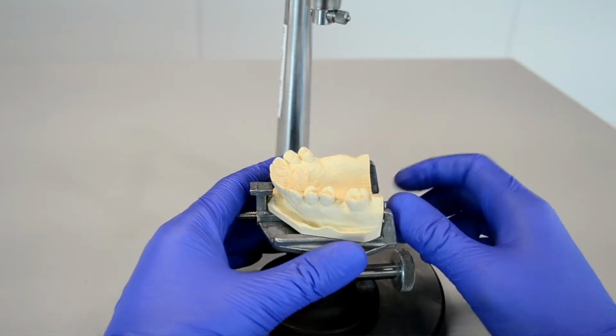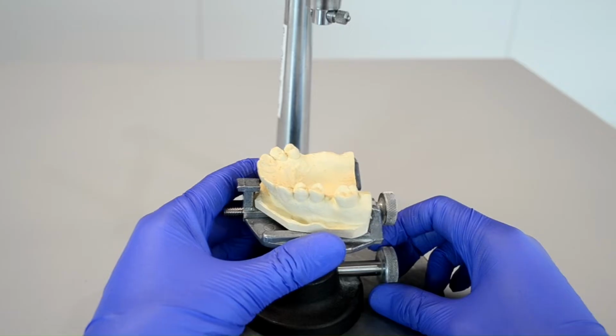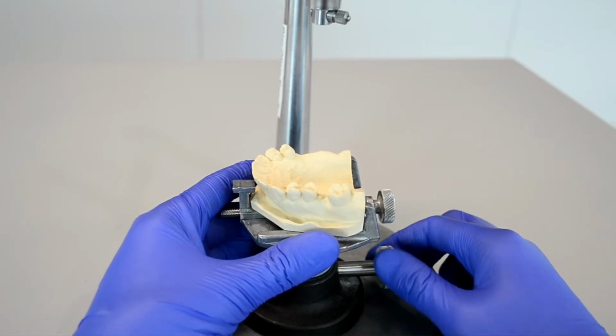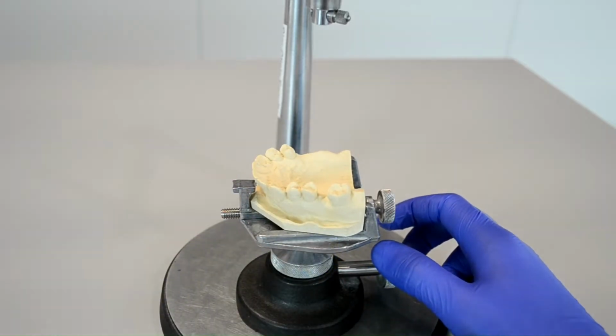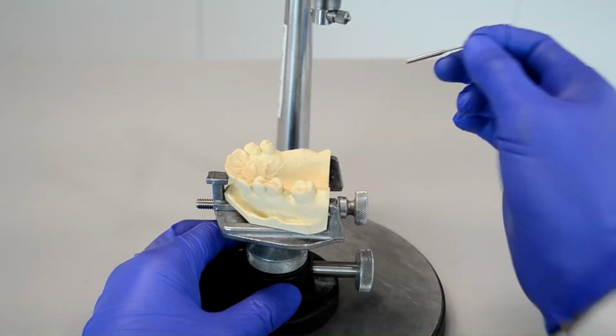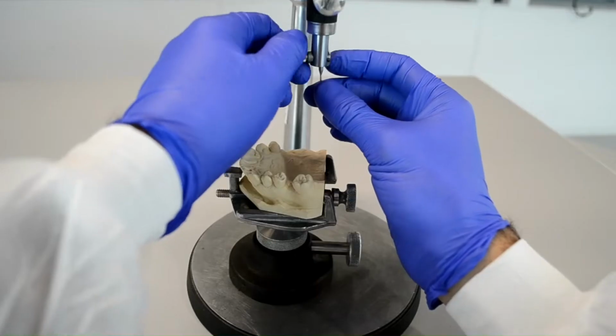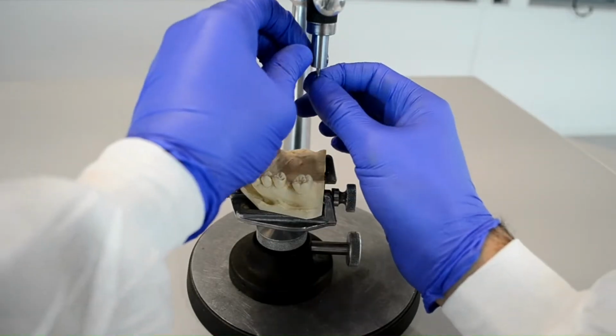We will start by securing the cast onto the table. You also want to make sure that the occlusal plane of the cast is fairly level with the horizon. The first step of surveying is to analyze the cast. This is done using the analyzing rod, which looks like this. We'll go ahead and put that into the mandrel.